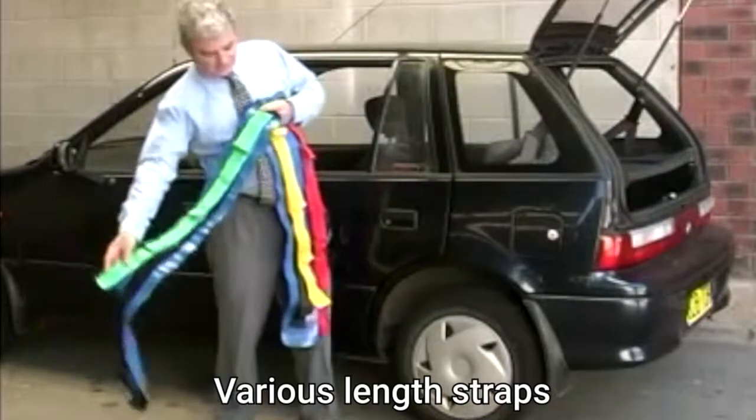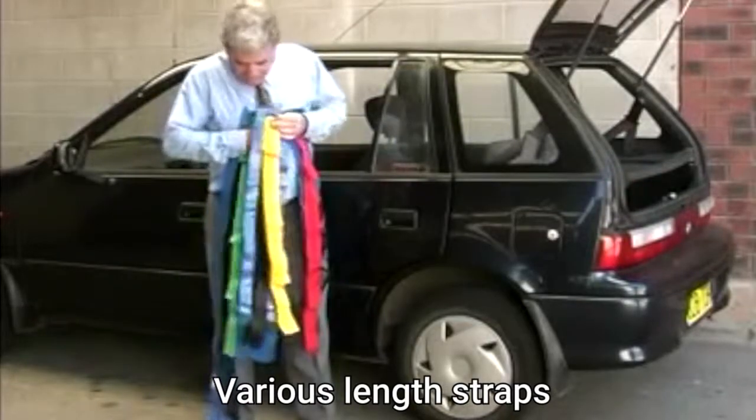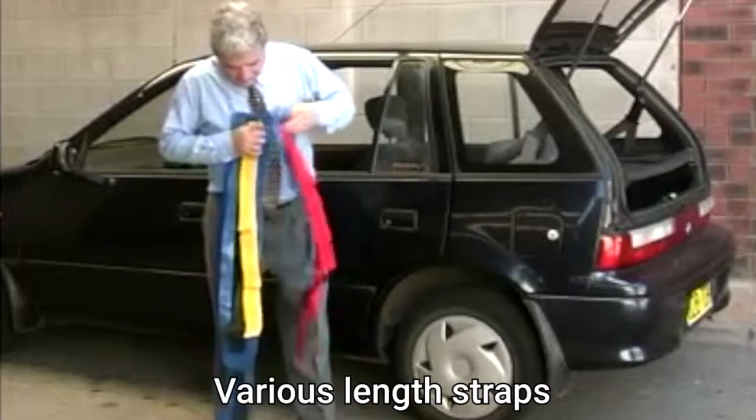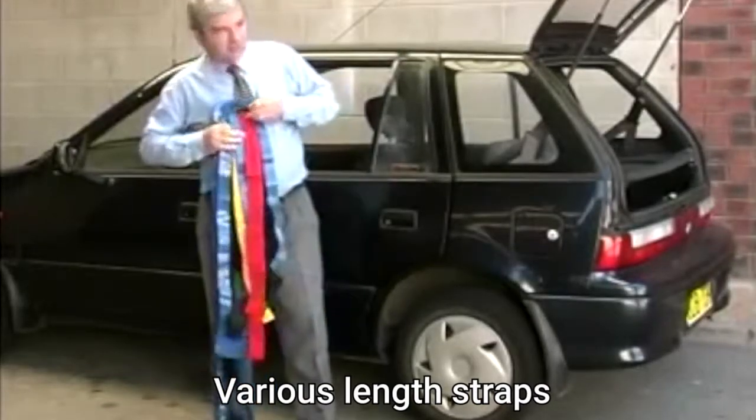Here we have the strap kit for evacuation of a patient. The green strap is large for the chest area. The yellow strap is medium for the thighs. The red strap is small for the ankles.